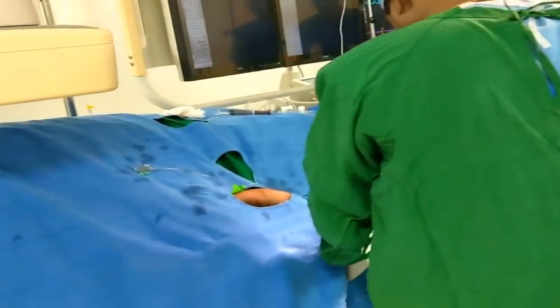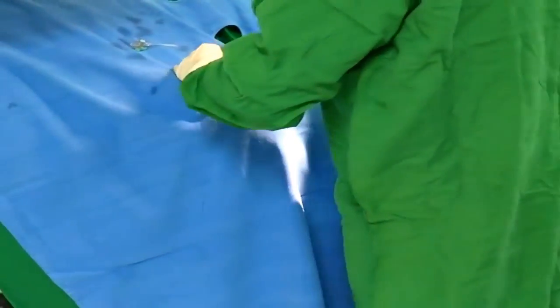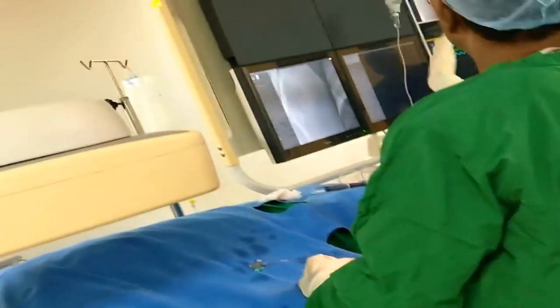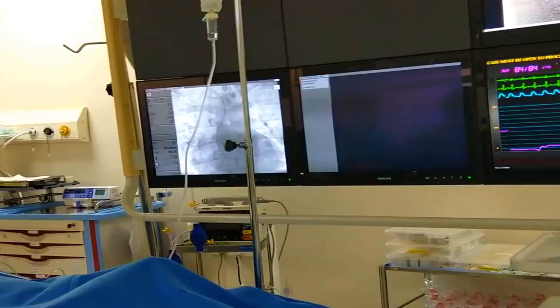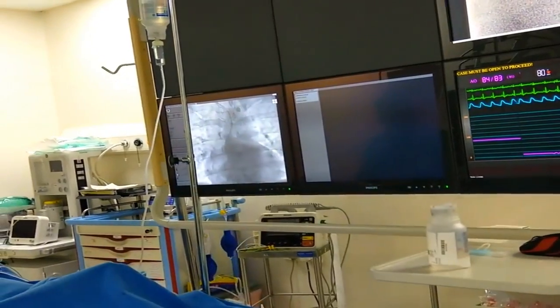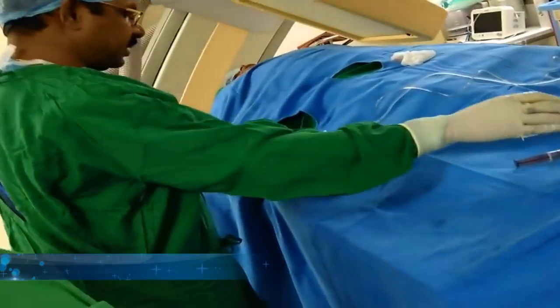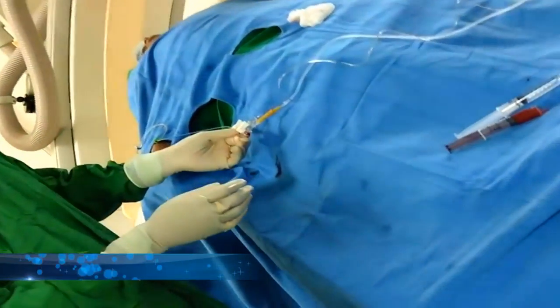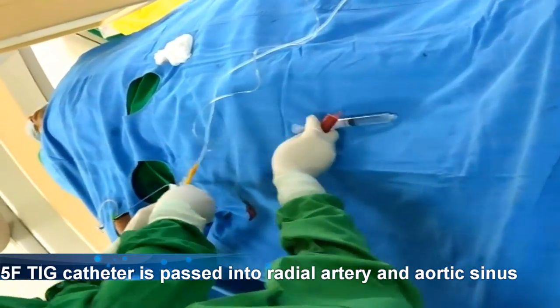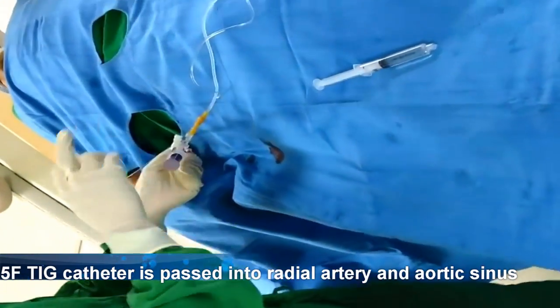During this injection, the patient may feel a little warm sensation in the right arm. We are giving counseling to the patient to bear the burning sensation, which lasts for 5 to 10 seconds. Now I am taking the diagnostic catheter to perform the angiography.